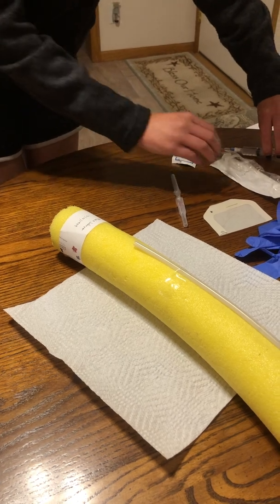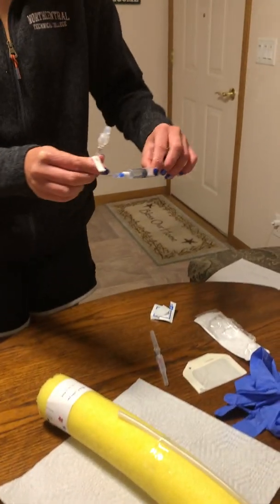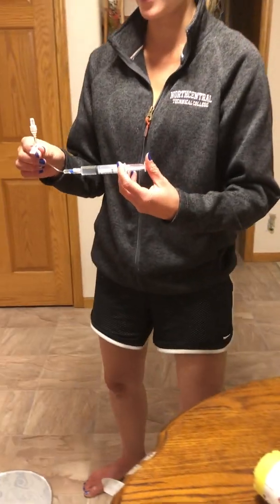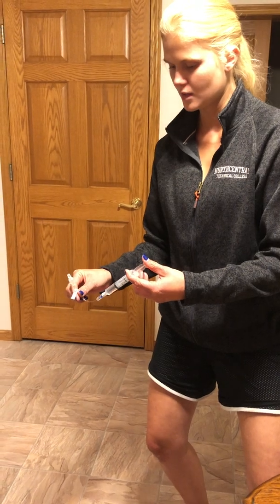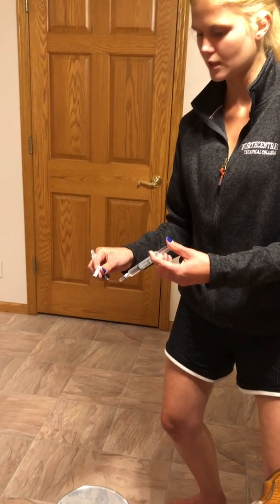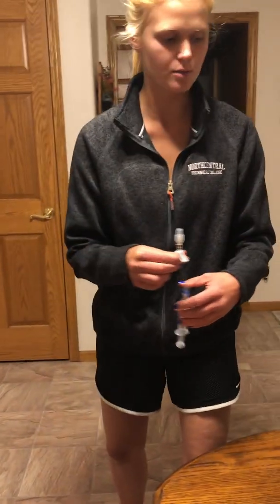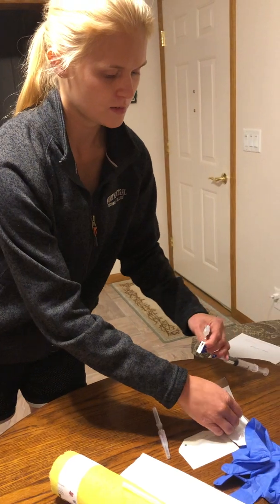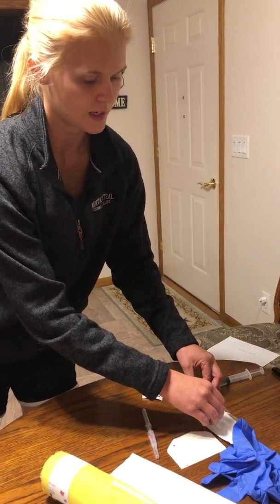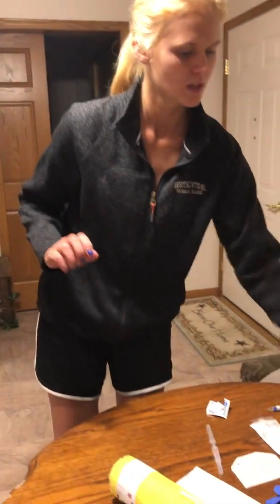Before I do that, I need to make sure that I use sterile technique, and I have my 5 milliliters in here. And I'm going to get all the air bubbles out of there. Good, so we have no air bubbles in there anymore. I'm going to put this back in here, make sure it's sterile in there. Good. Now I'm going to check the expiration date on their saline, and we are good for that.